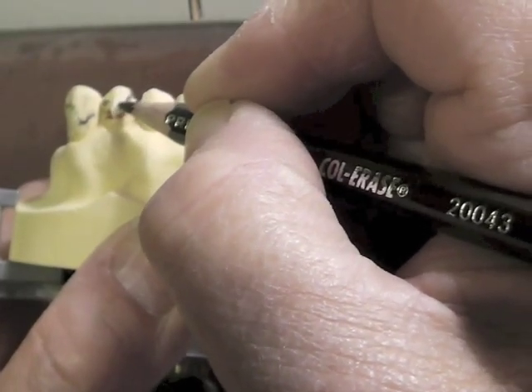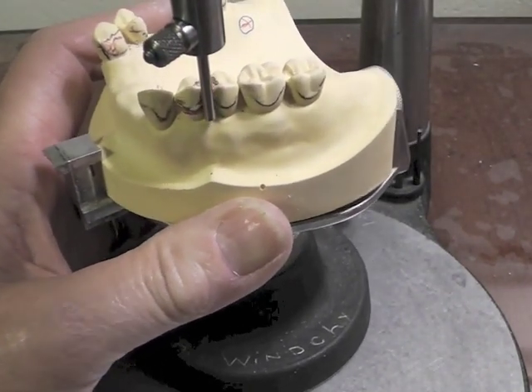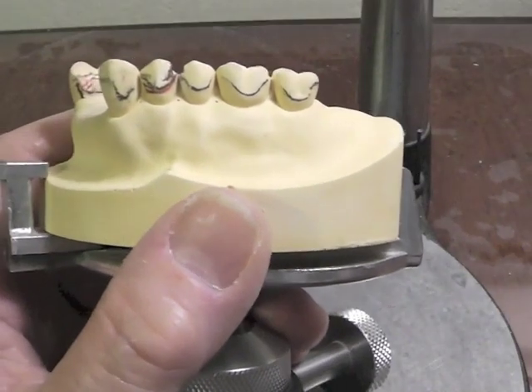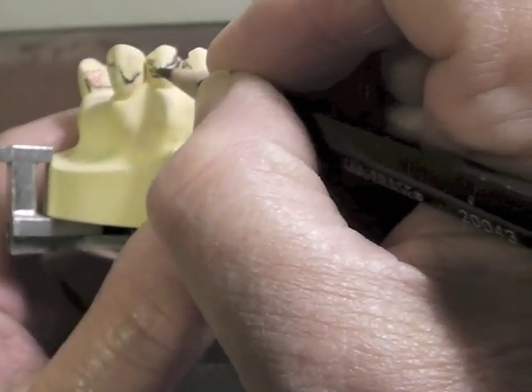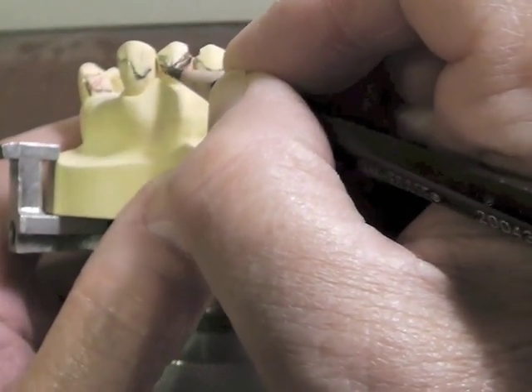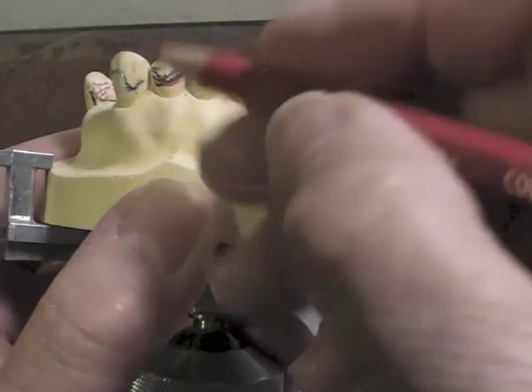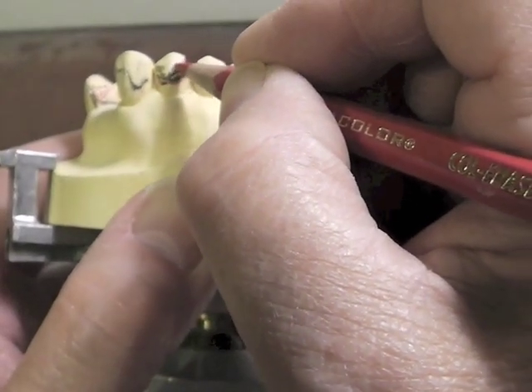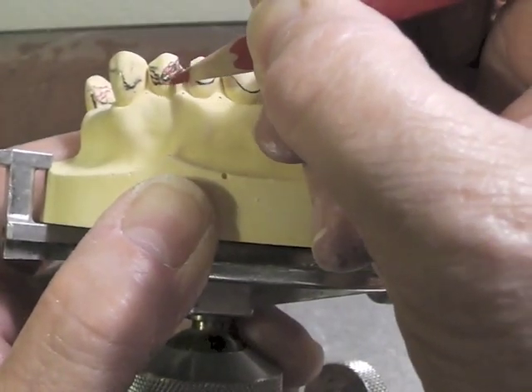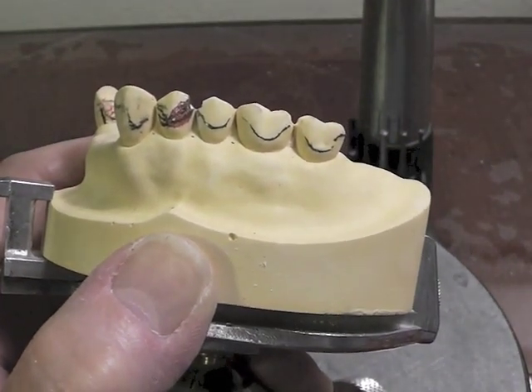I'm going to bring that arm down now. I'm going to check to see if I have in fact lowered my survey line there. When I run this along with my surveyor, I have in fact lowered my survey line down to this position. Now I can draw my direct retainer arm entirely above the new survey line in that original two thirds. That's my new position of my survey line. I've got to remind myself by placing the circle here that I'm going to have to come back and adjust my tooth when I get to the tooth preparation stage.